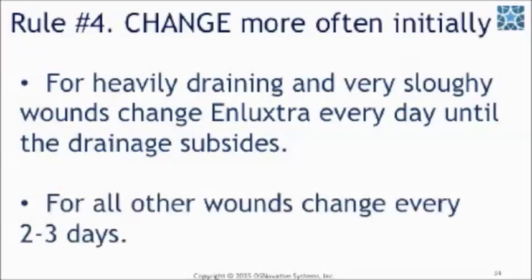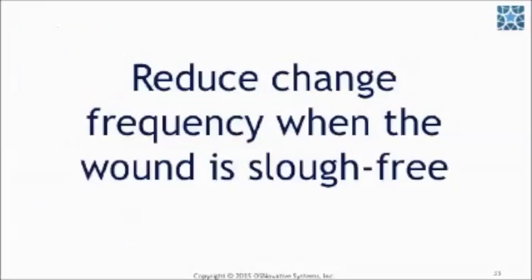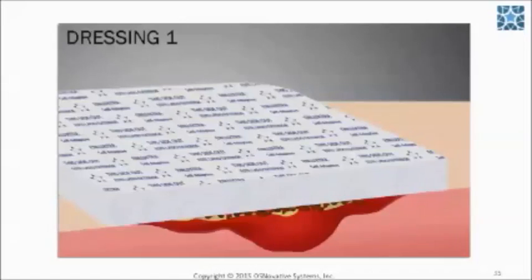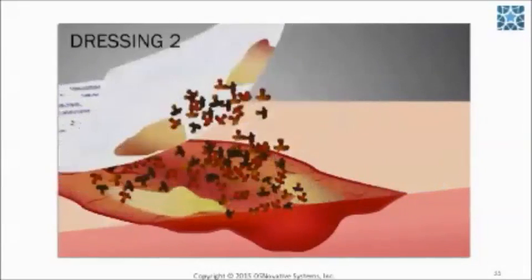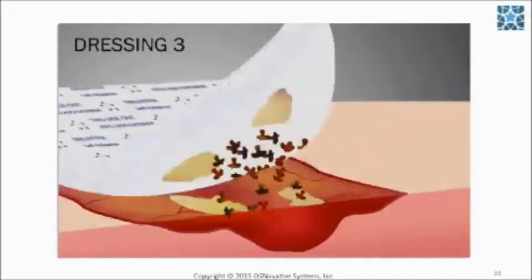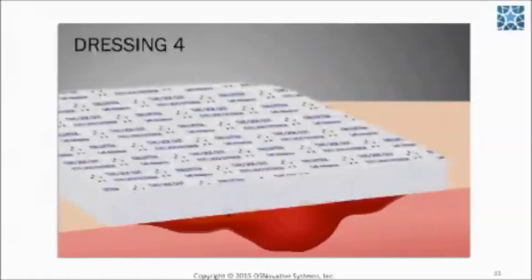For all other wounds, change every 2 to 3 days. You may reduce the change frequency when the wound becomes about 80% free of slough. At this point, change frequency may be gradually reduced for up to 7 to 10 day wear time.